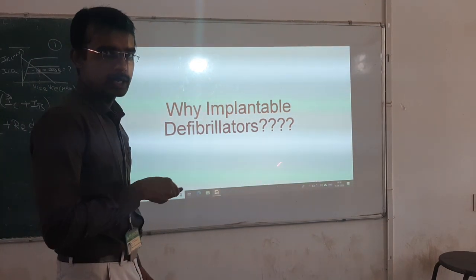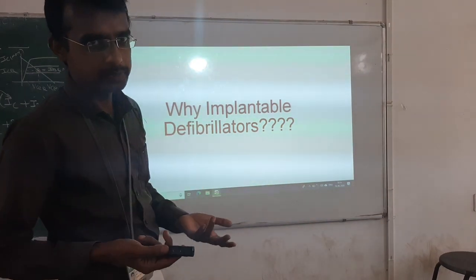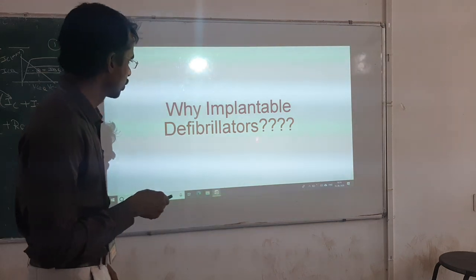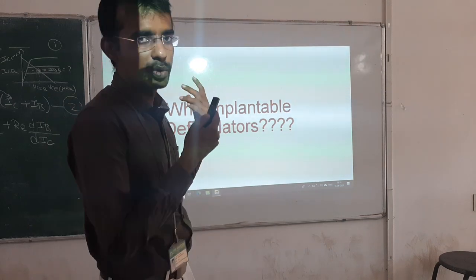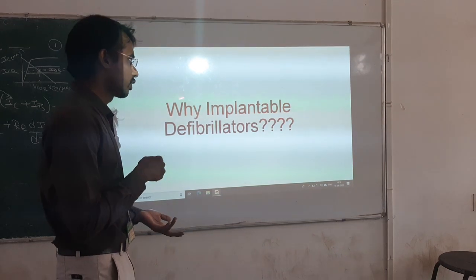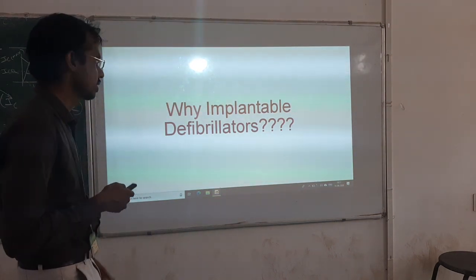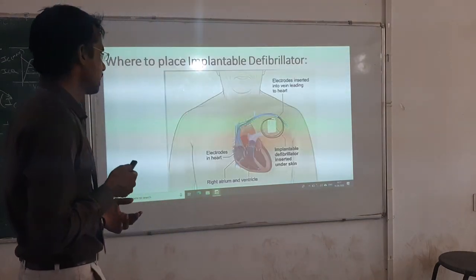why are implantable defibrillators required? It's very simple. Whenever the patient has fibrillation very often, then we need to go for an implantable defibrillator, because if fibrillation comes suddenly, you need not run to the hospital. Anything can happen on the way. So for permanent damage to the nervous system or fibrillation conditions, we will always go for implantable defibrillators. That's the only reason, like implantable pacemakers. This is the reason for going for an implantable defibrillator.